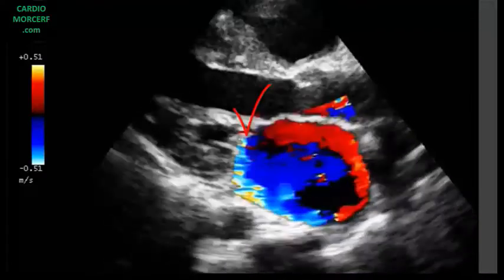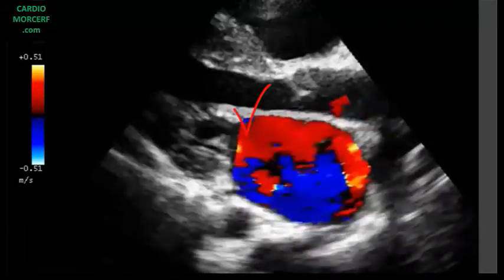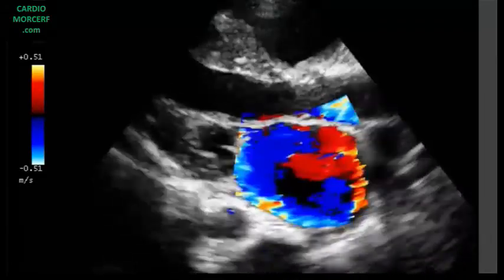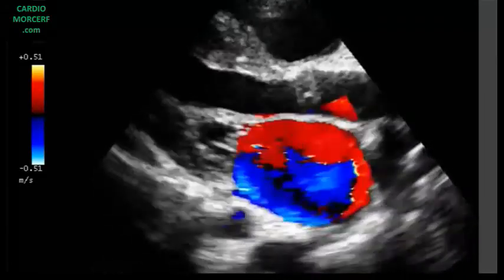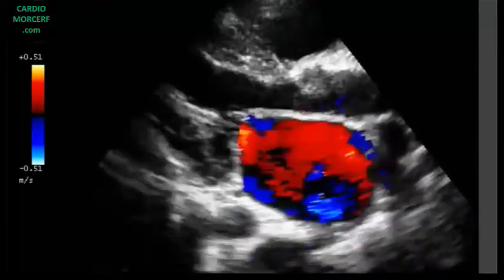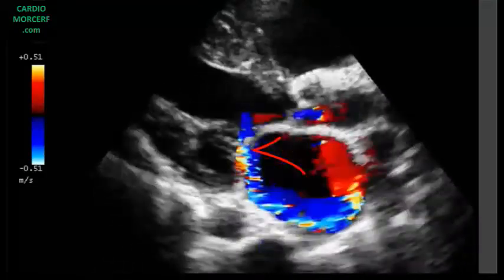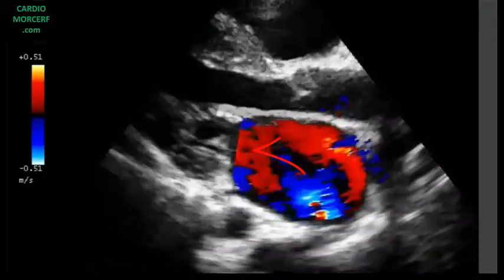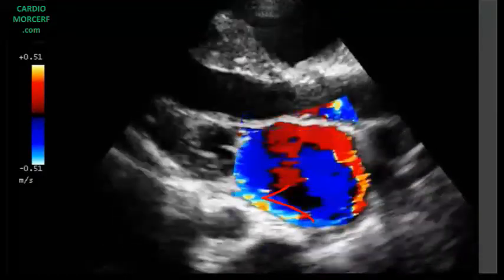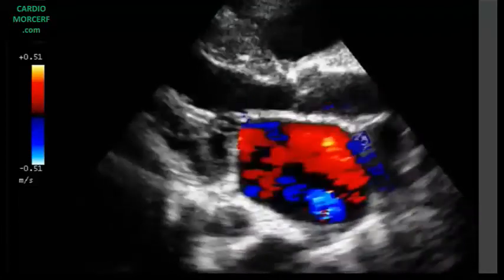Here is the case. A regurgitant jet started here, and if it were a central jet with no leaflet or wall constraint, it would be a large jet. However, it soon impinged on the posterior leaflet and later the left atrial wall and cannot get free, and the jet seems to be thin.